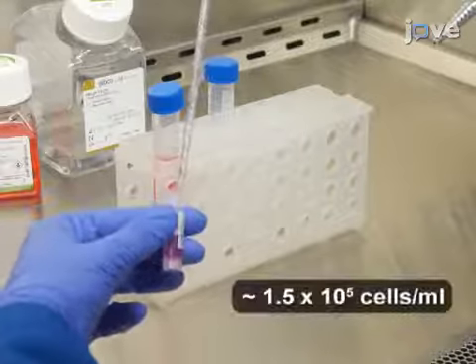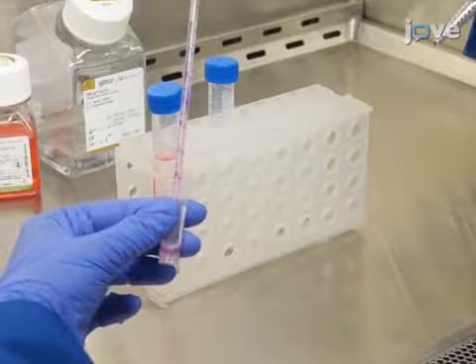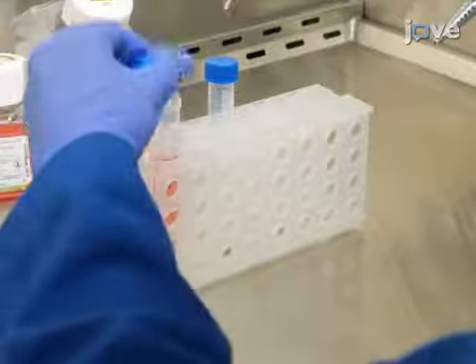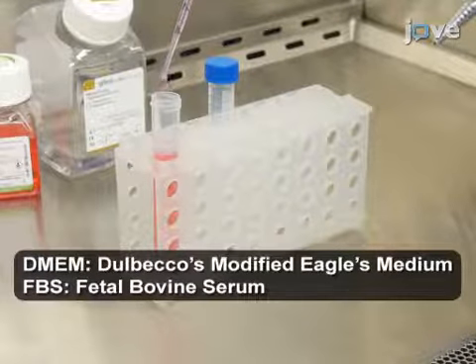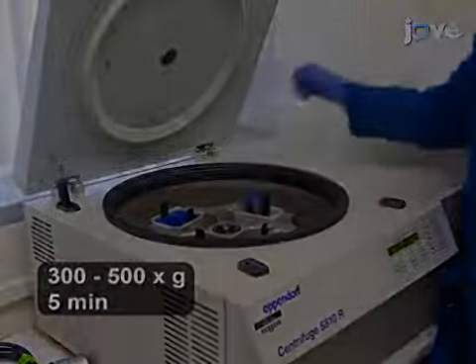Then, pipette the cells from the vial and deliver the entire volume drop by drop slowly into a 15 milliliter conical tube containing 10 milliliters of pre-warmed growth medium, such as DMEM supplemented with 10% FBS. Next, remove the DMSO by centrifuging the tube for 5 minutes.